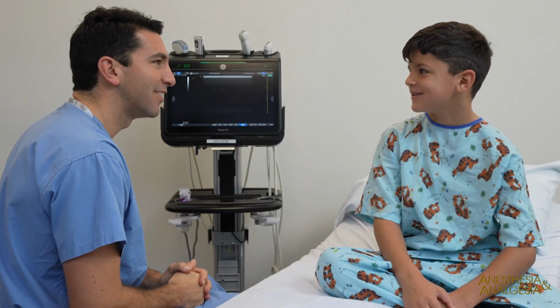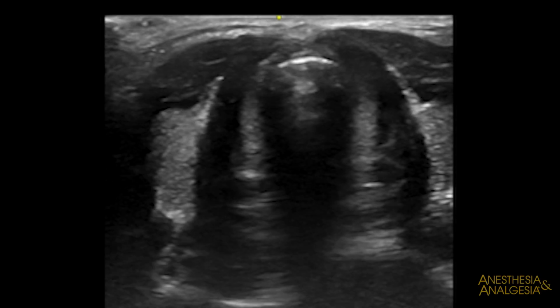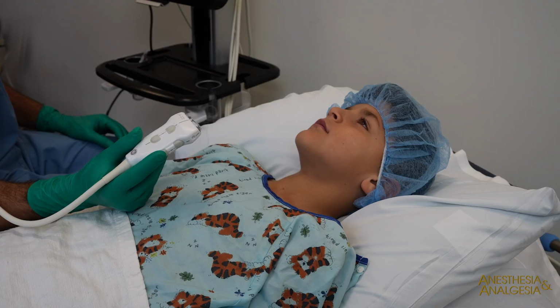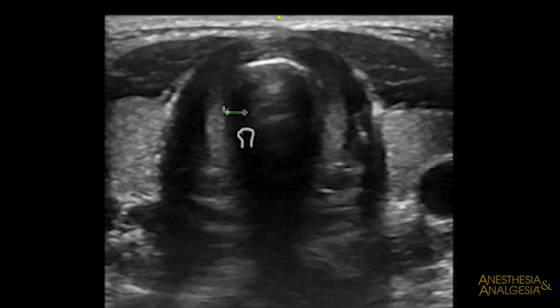Estimating proper endotracheal tube size is critical, especially for pediatric patients. The smallest diameter of the airway corresponds to the diameter of the cricoid cartilage. To determine this measurement, place the linear probe in the transverse plane at the level of the cricoid cartilage. Measure the transverse diameter of the air column.